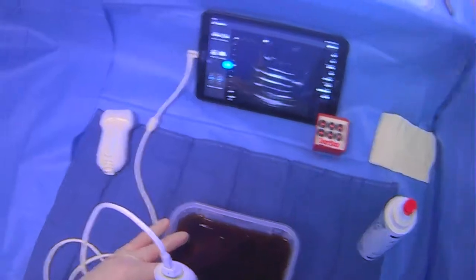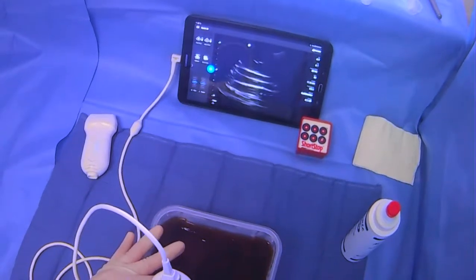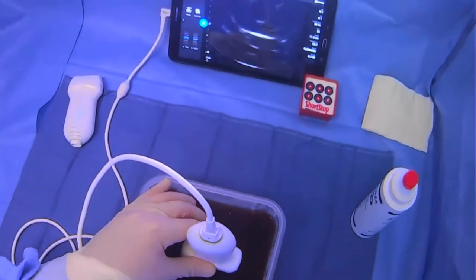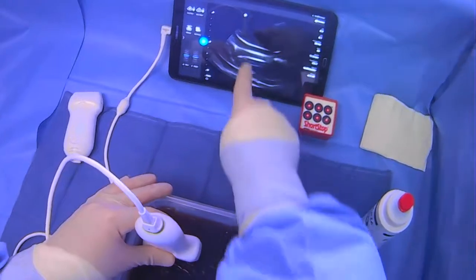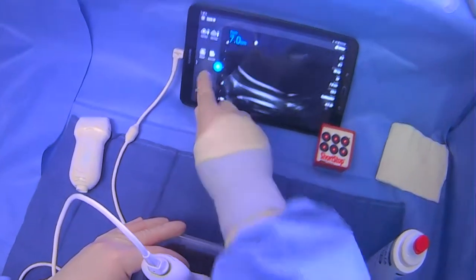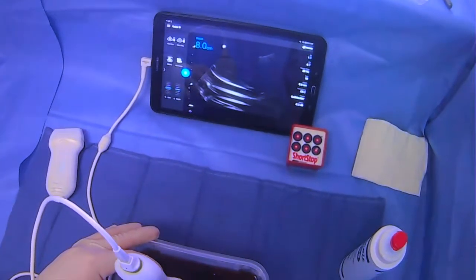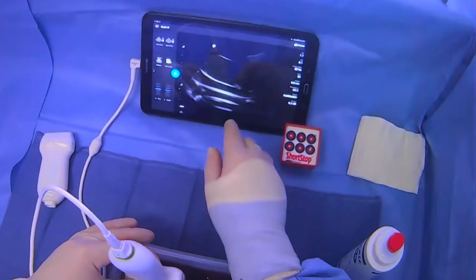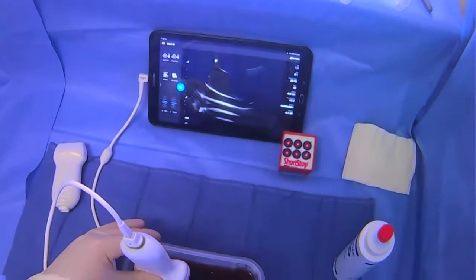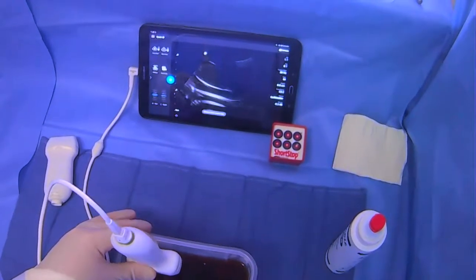So here we're going to scan and get a sense of what is going on. Already we can get a tell that maybe there's really not that much ascites here — maybe there's some there. Potentially this catches our eye here, and looking at the scale, this is pretty superficial. We can zoom in a little bit to get better resolution, and now we can tell it looks like there is a collection right here. But because we're using the curved probe, which doesn't have as high a frequency, we're having a little bit of trouble getting a sense of what's going on.